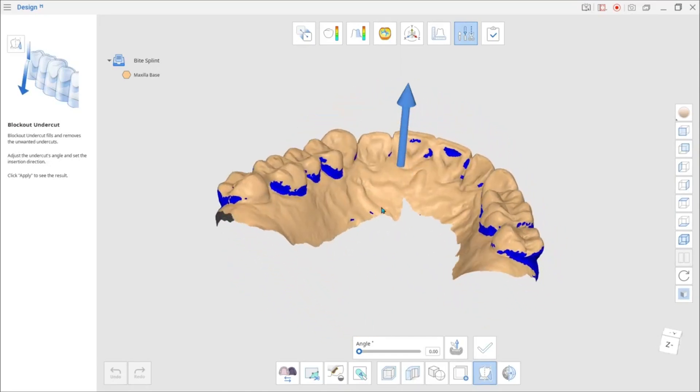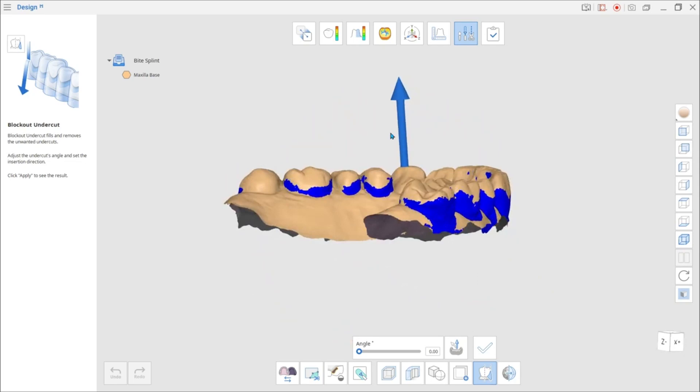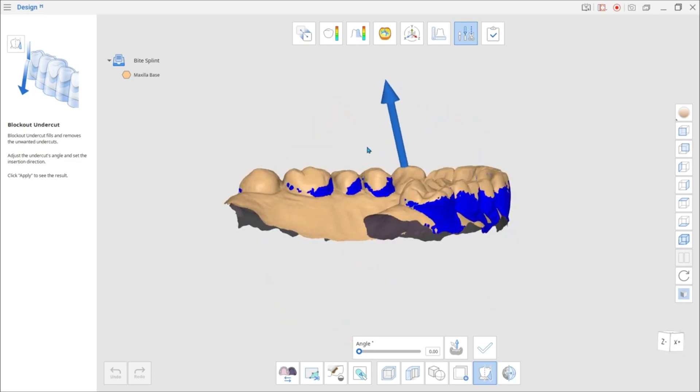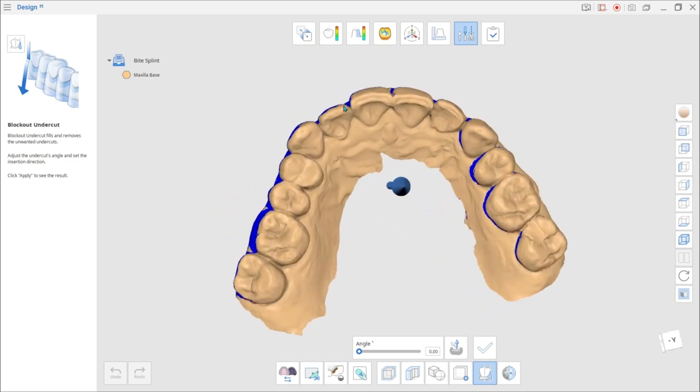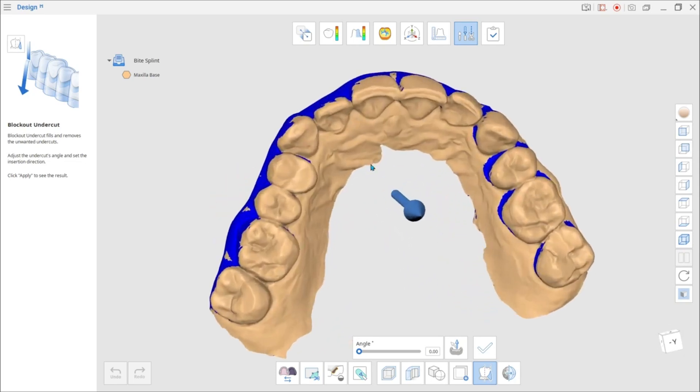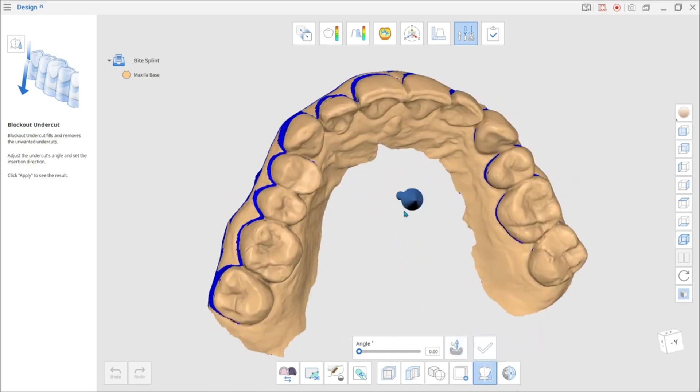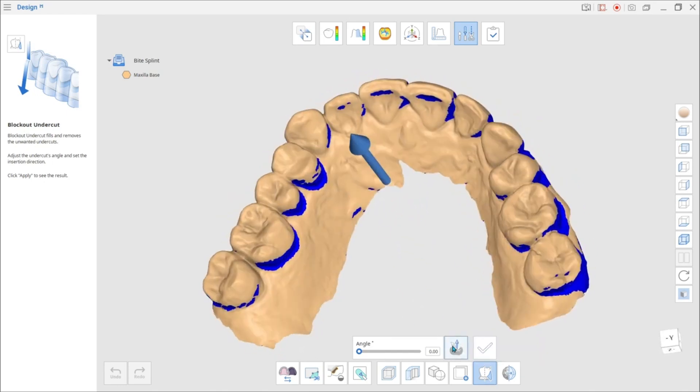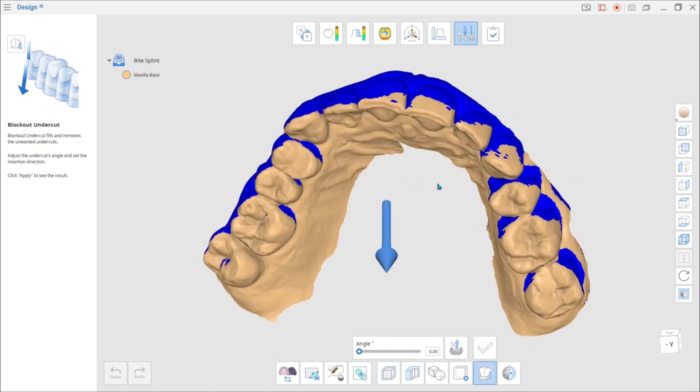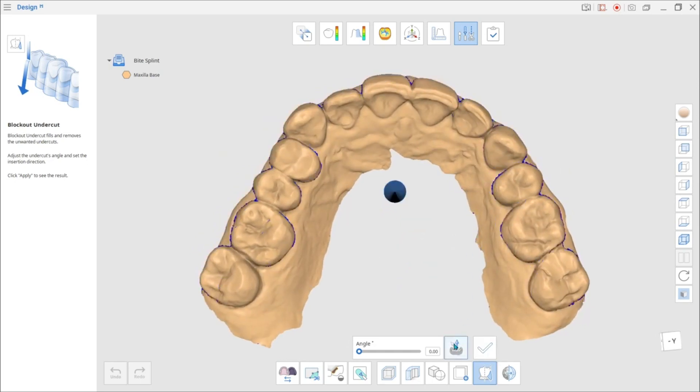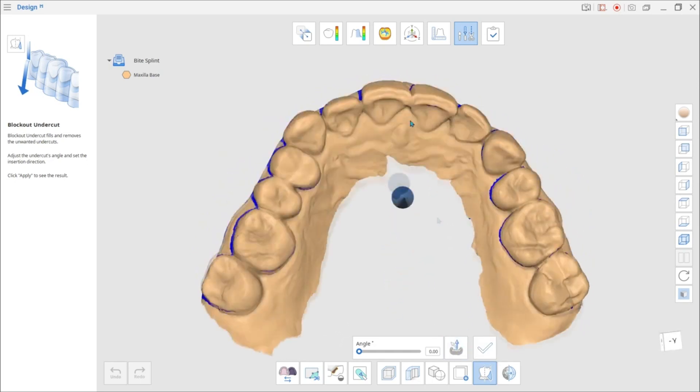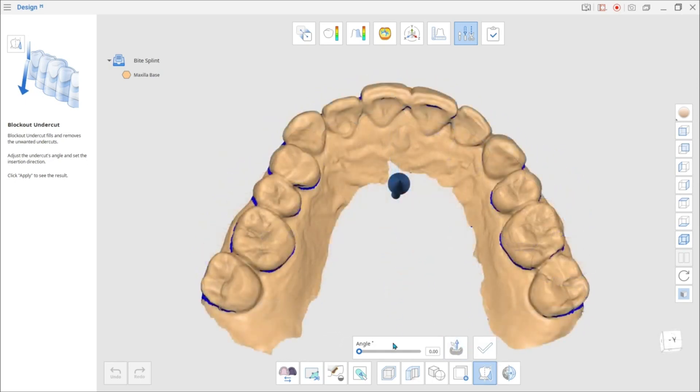To set the insertion direction to face toward you, adjust the data position and press Set Arrow to your viewpoint. The Undercut will change accordingly to the modified path of insertion. Click Apply to see the result.